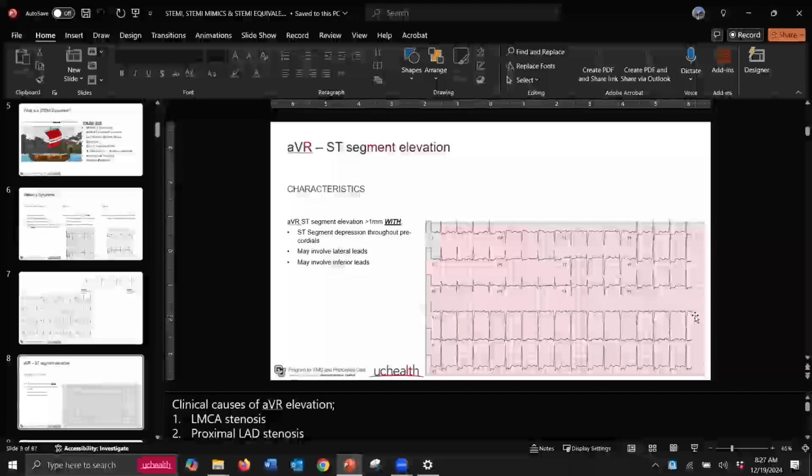That's what this EKG says to me: great, I'm glad my patient's compensating if they are, but I'm going to be very cautious. I'm going to be very ready. I'm going to have 3 different therapies set up for when they do crash. And if I don't have to use a pressor at the end, great, I'll throw it back in the box, but I'm going to lay it out. I'm going to be more anticipatory in my clinical management of this patient.